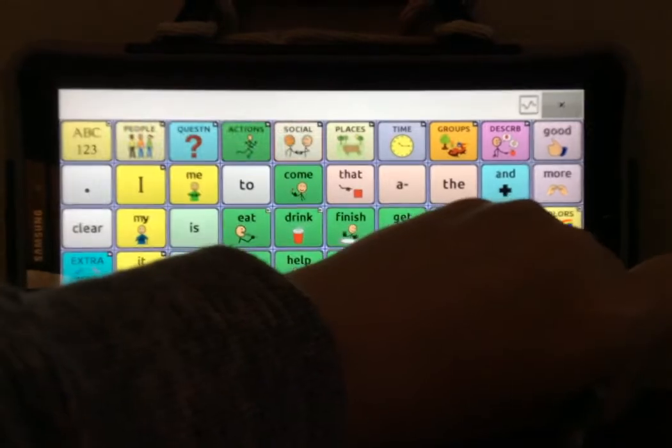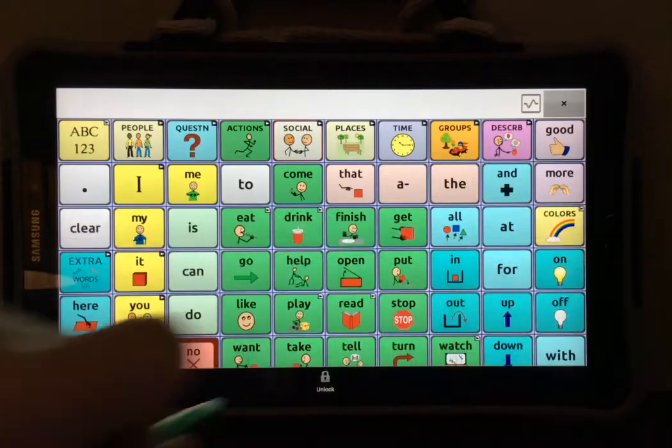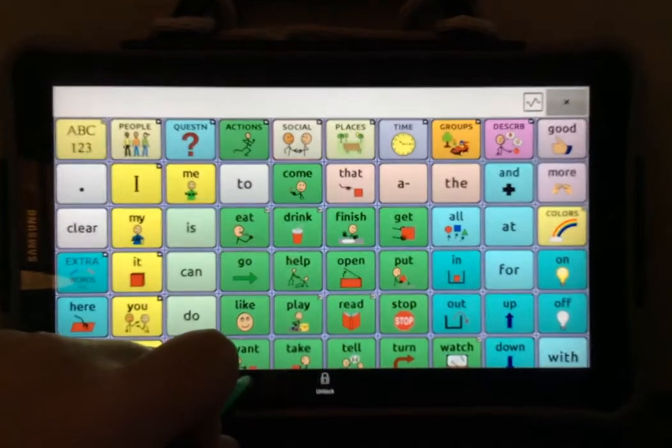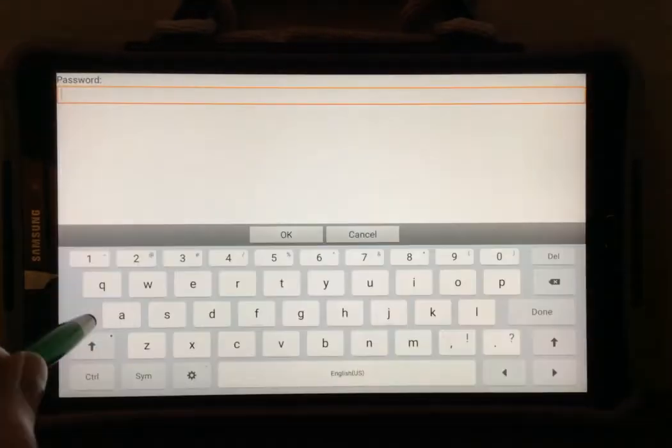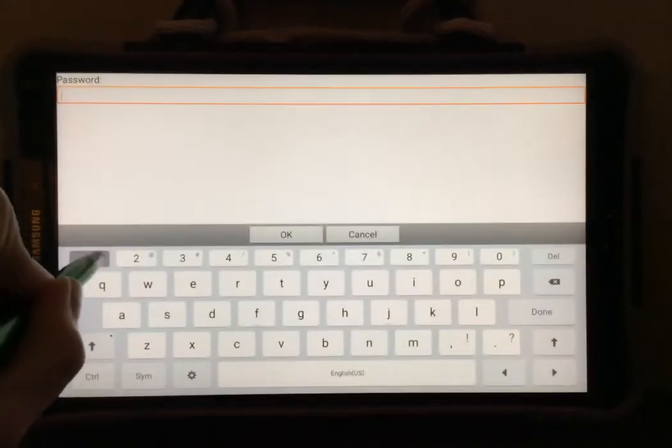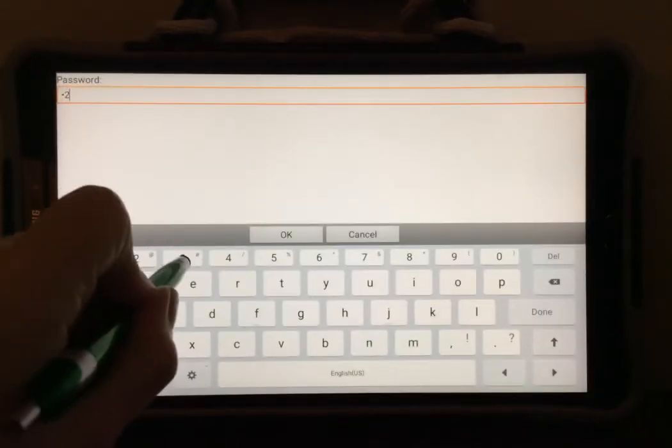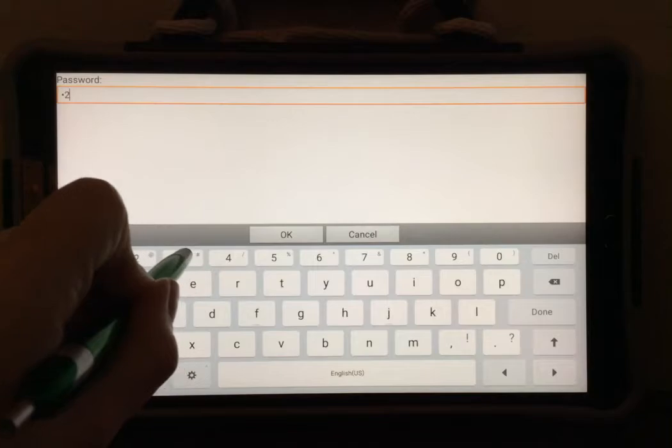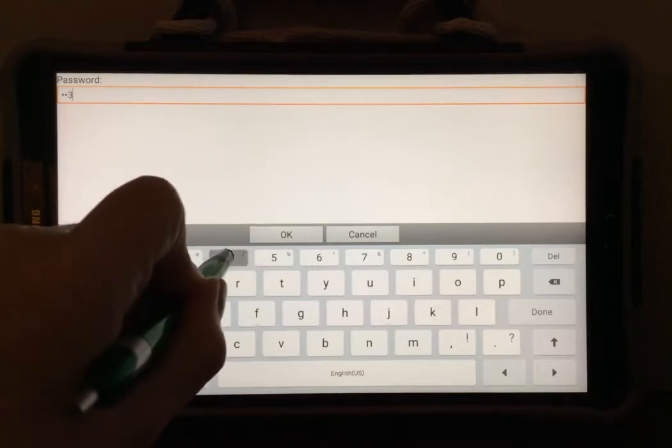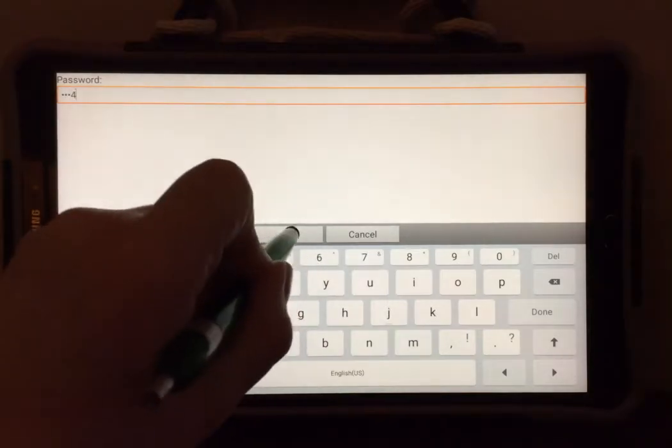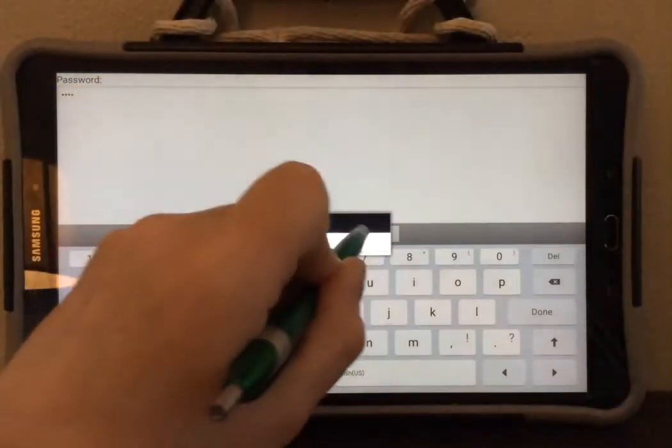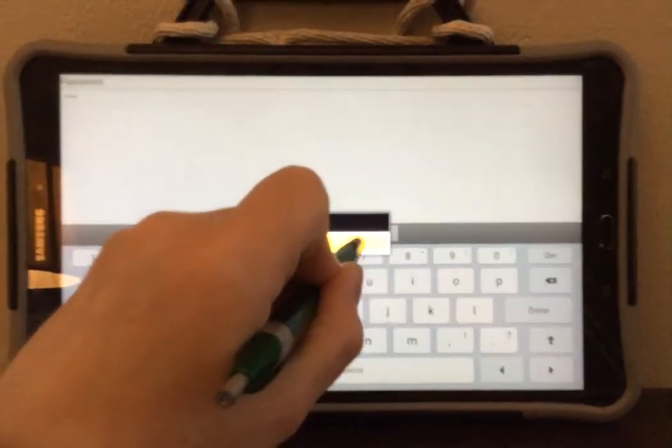The first thing you're going to do is select the menu button and select unlock. Type in your password, select OK, and select no.